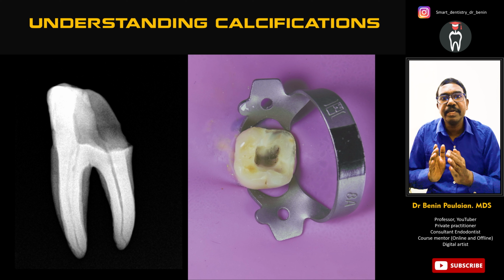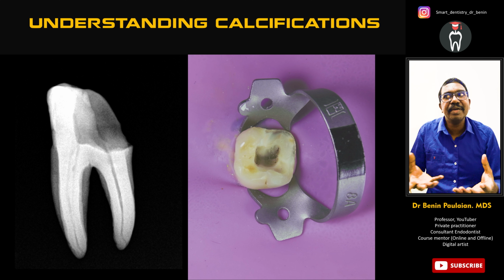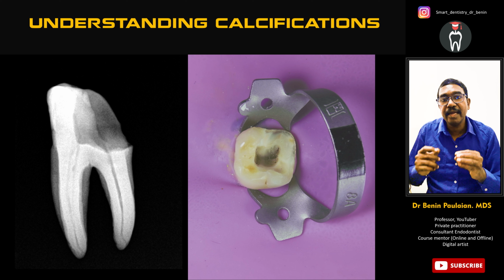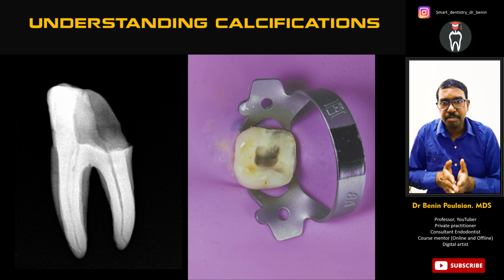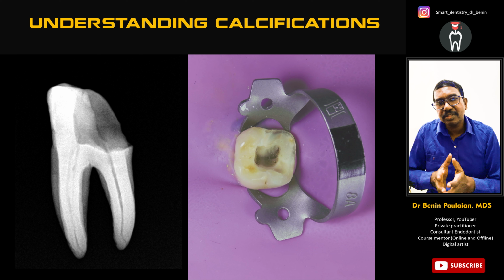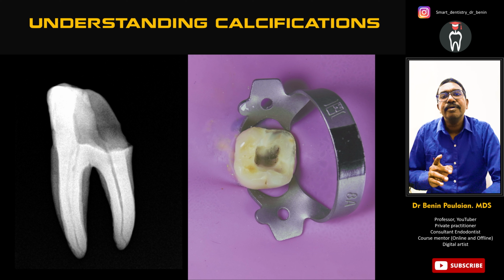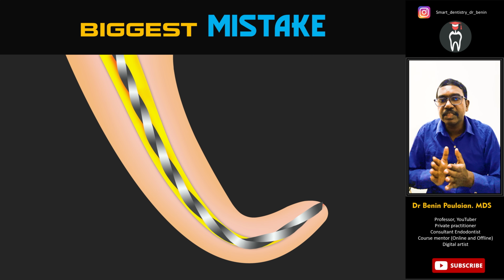The canals will be quite narrow, but not completely absent, as you may think. In many clinical situations we complicate the canal with some form of procedural errors like canal blockage, ledges or incomplete canal negotiations, and we complicate it rather than the canal being absent. In most clinical situations, the canal will be present, but it will be very narrow. So we shall use a technique in order to negotiate it without any complications.